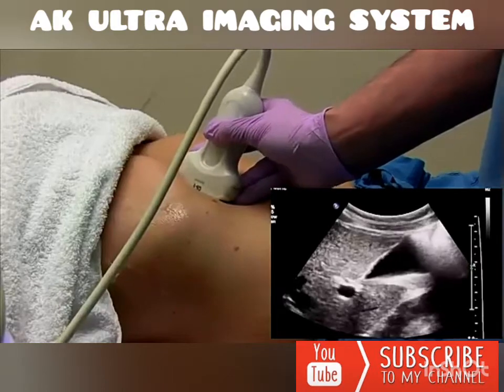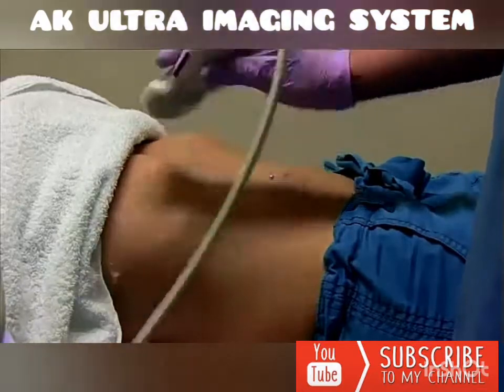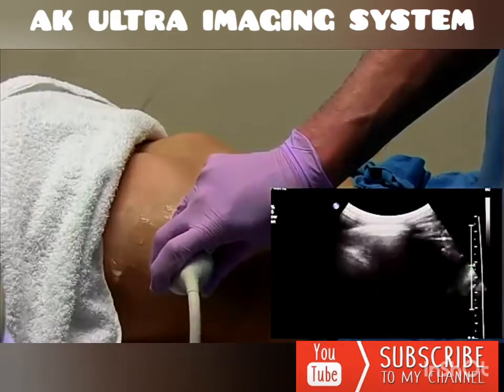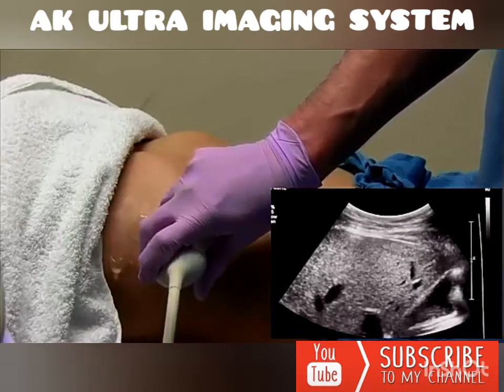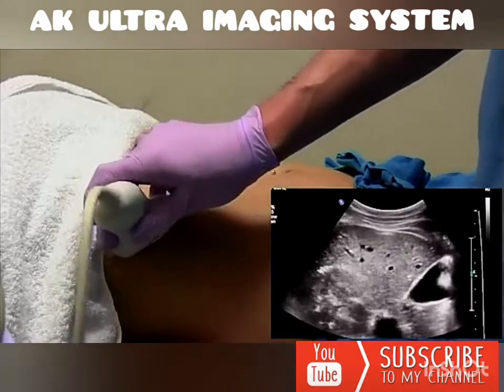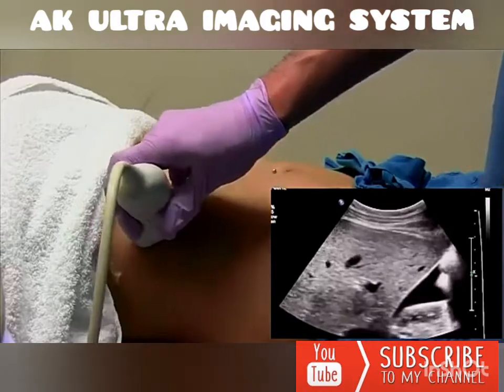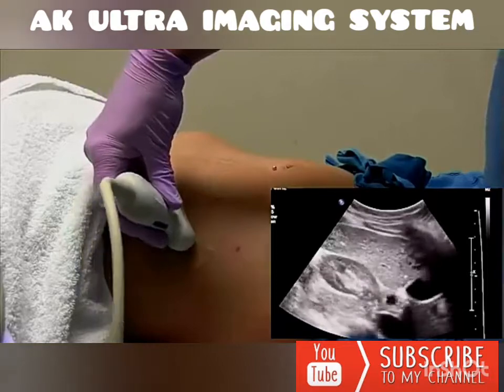Another really good window for the gallbladder, especially for bigger patients or gassy patients, is if you come intercostal and angle up towards the anterior part of the abdomen. Again, you're just going to open up the gallbladder to get its widest portion here. And same thing, once you find that sagittal window, to get a transverse, look at your probe and turn it 90 degrees to that plane.